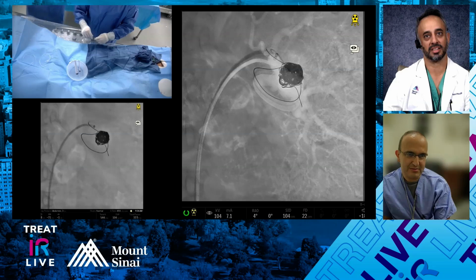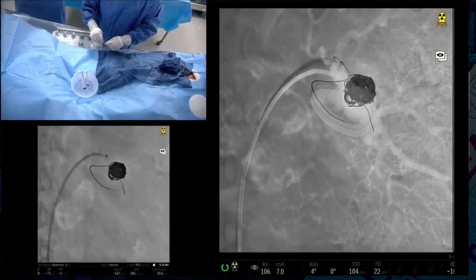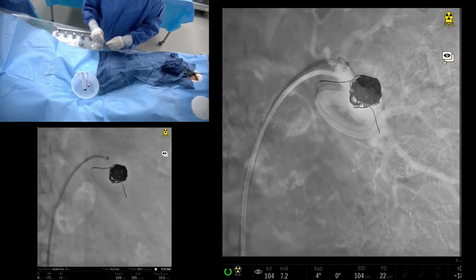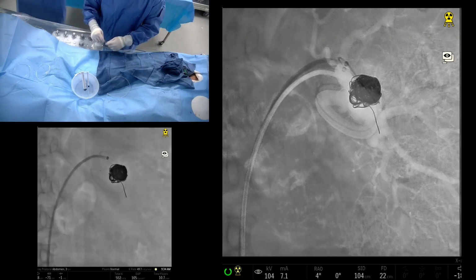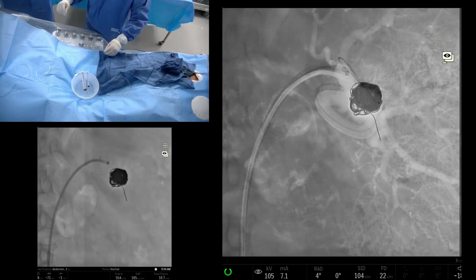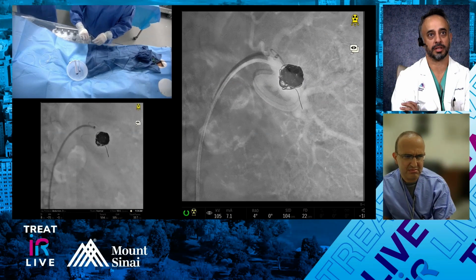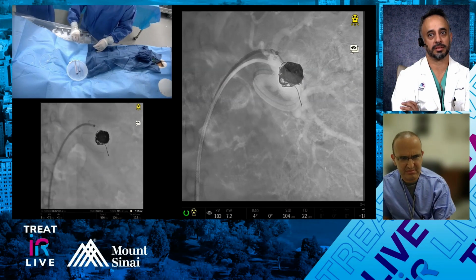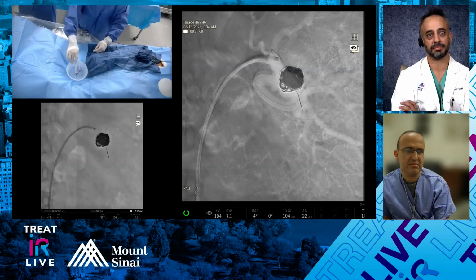All right, so I'm just pushing this 18, then we're going to downsize to like a 10 or a 12, and then probably just do the inflow, and we should be done. What's the smallest fiber size that you have? Yeah, it comes to a 2x4, and then there's also the softs as well.